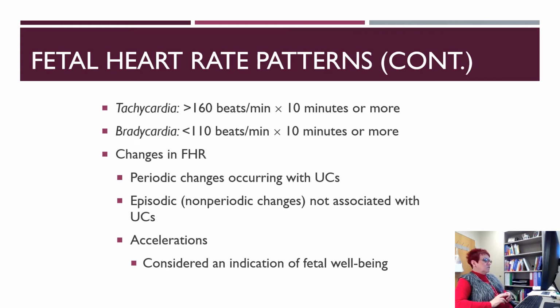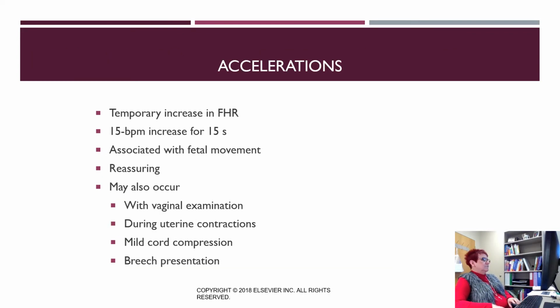Sometimes there's changes just related to the uterine contractions, and sometimes there's changes that are not associated with uterine contractions. Accelerations, which is what we've talked about before, are a good indicator of fetal well-being. Good sign. Okay. Accelerations, as you see here, associated with fetal movement is reassuring.